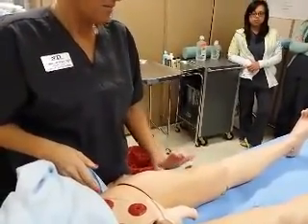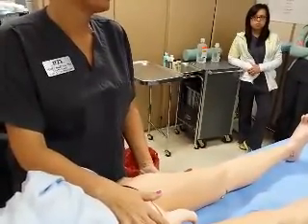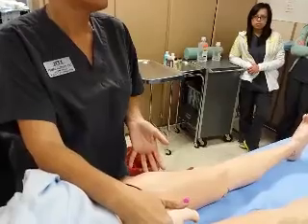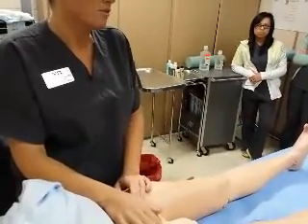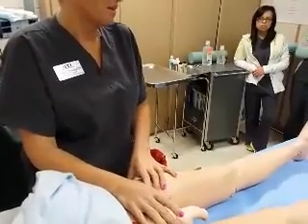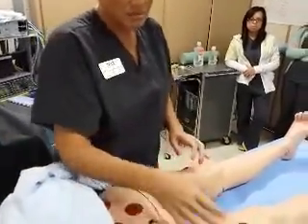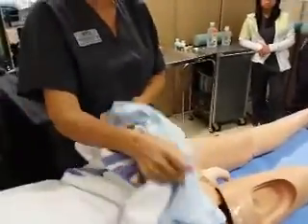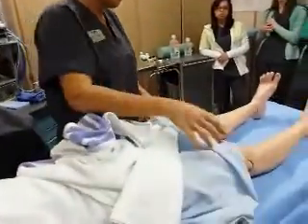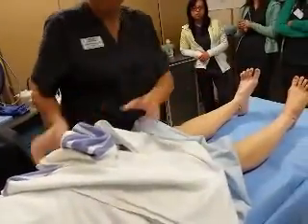And a lot of times for that, depending on the surgeon, they would have to change the patient's position. They would put them in a lateral position, like for a hip surgery. You would prep them in a lateral position. Prepping is a real chore for hips. But luckily, most scrubs don't do that. The circulating nurse does. So for us in here, we're just going to work from the knee down.